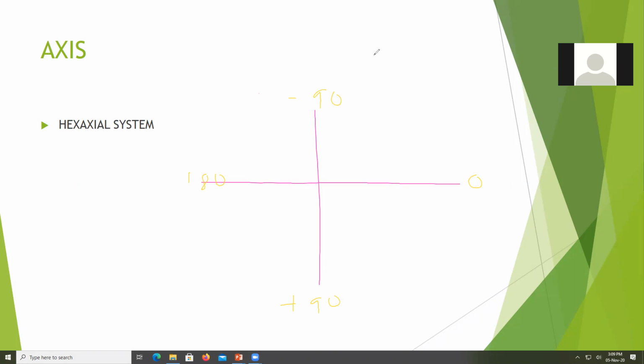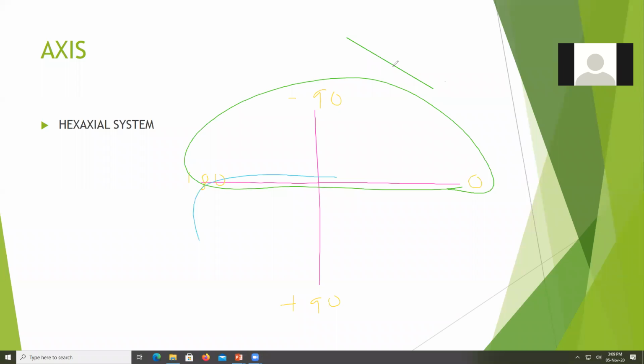Okay, the upper portion of this diagram, I'll color it green for negative. This one, the upper portion of this, is considered negative. So that's all negative going up. And around here, going down, are all considered positive. Normally it should be the other way around. Usually going up is positive and going down should be negative.